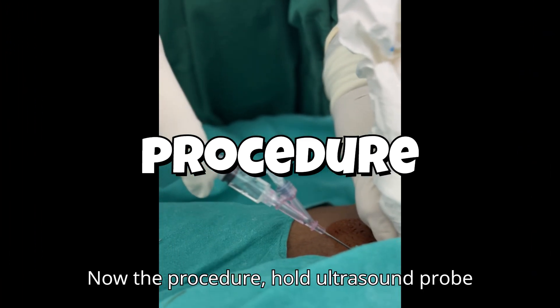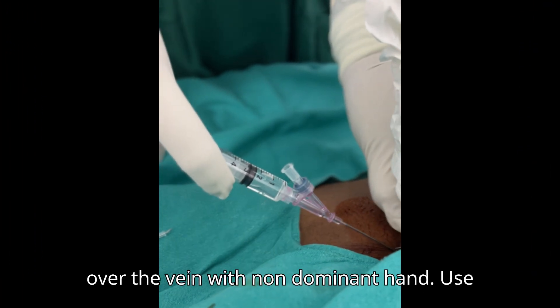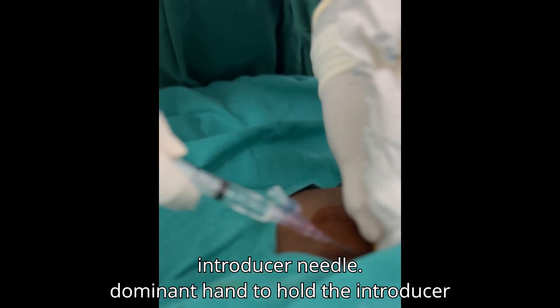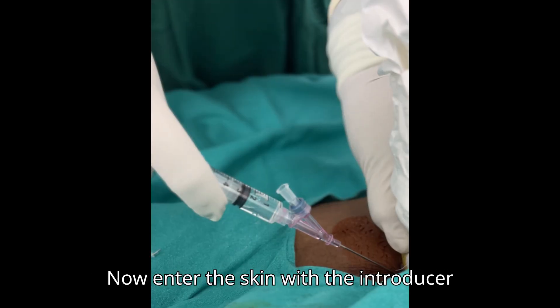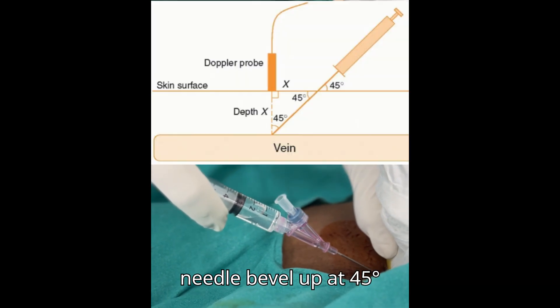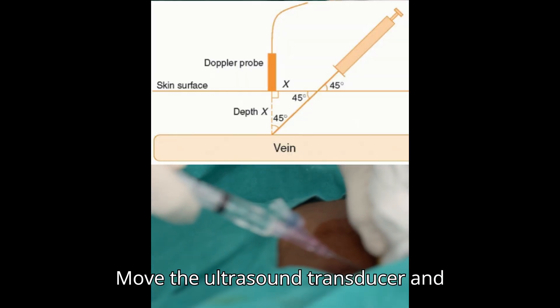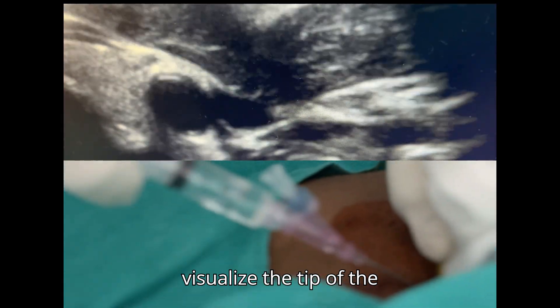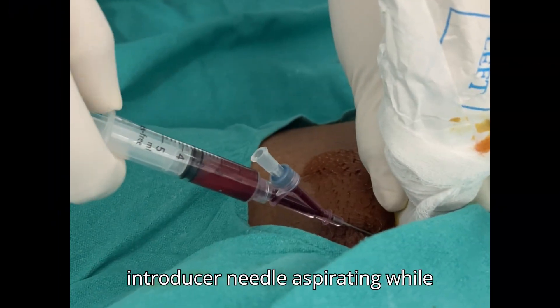Now the procedure. Hold the ultrasound probe over the vein with the non-dominant hand and use the dominant hand to hold the introducer needle. Enter the skin with the introducer needle bevel up at a 45 degree angle. Move the ultrasound transducer and introducer needle together in order to visualize the tip of the introducer needle, aspirating while advancing.